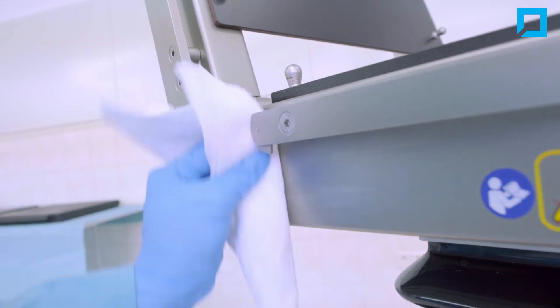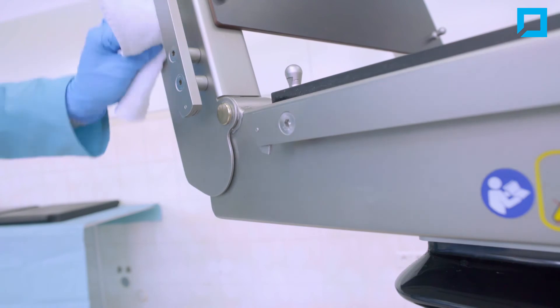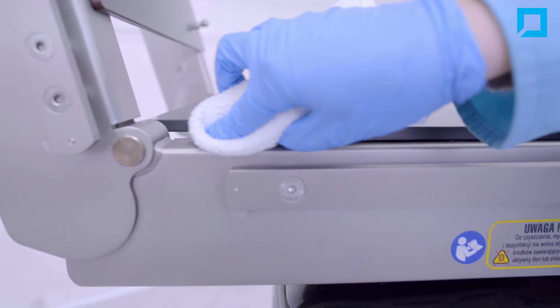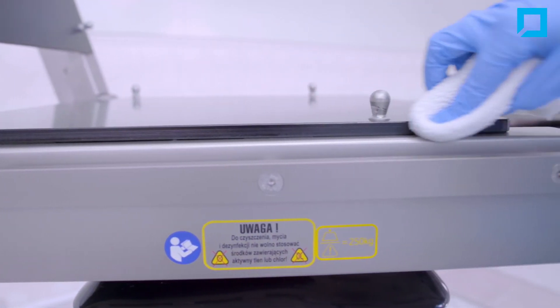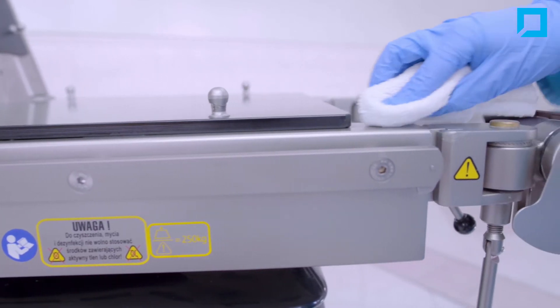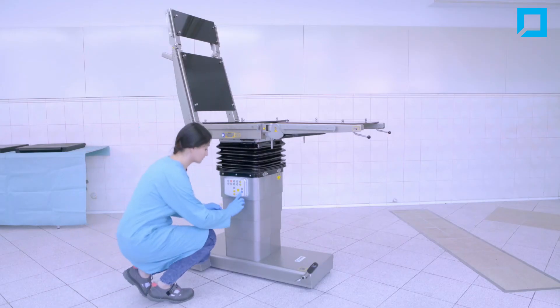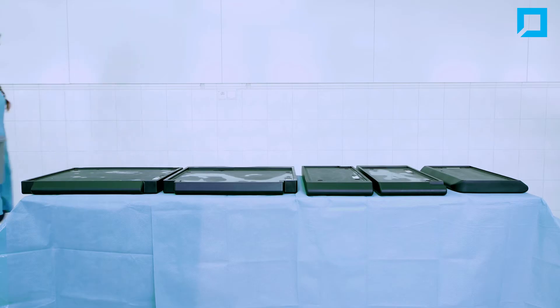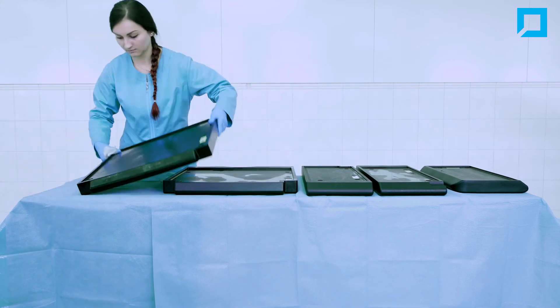Pay special attention to the covers and edges of the table. Set the table to the zero position. Wash off the mixture from the mattresses with a damp cloth.